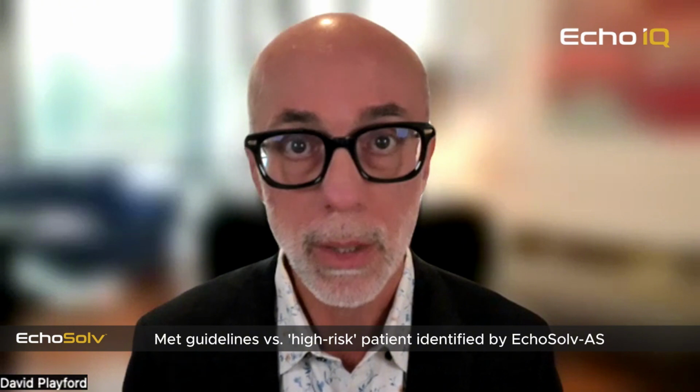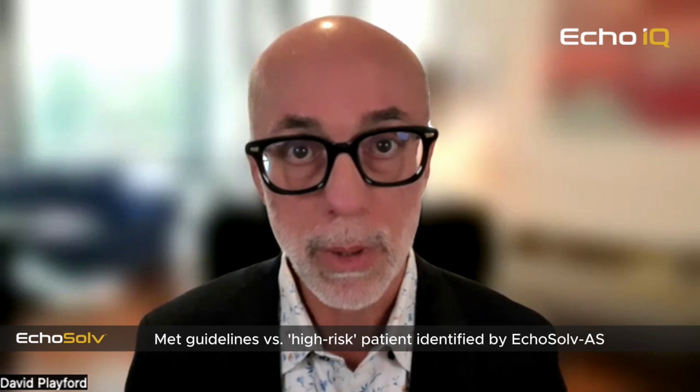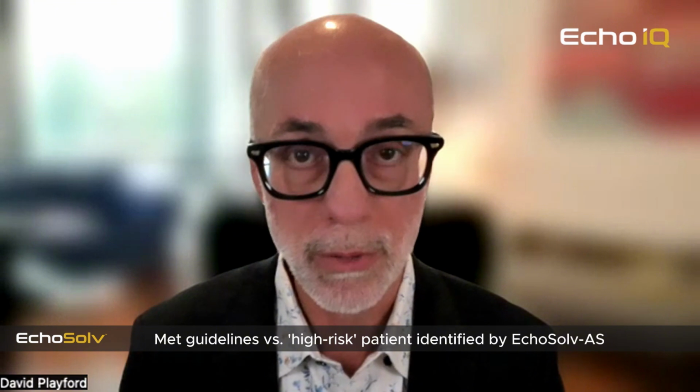But what the artificial intelligence does, as mentioned in the previous videos, is take all echocardiographic measurements performed, which includes the aortic valve gradient measurements that were done at the transthoracic echo, plus all of the other measurements, and then provides an overall phenotype. There are three groups. There's the high probability, which is the high risk phenotype. There's the medium probability, which is the medium risk phenotype. And there's the low probability, which is also the low risk phenotype.